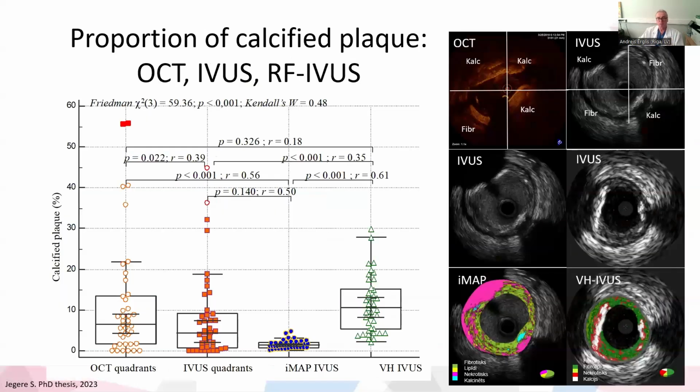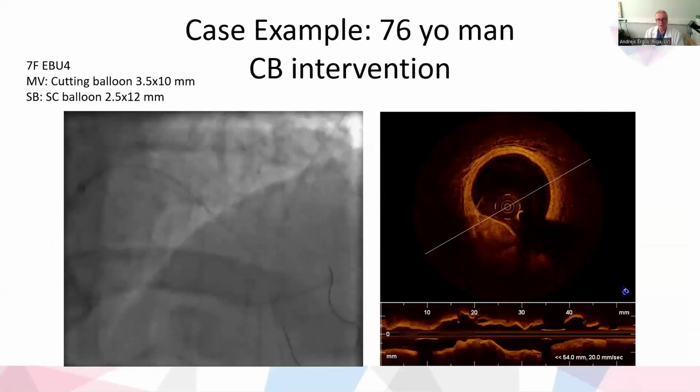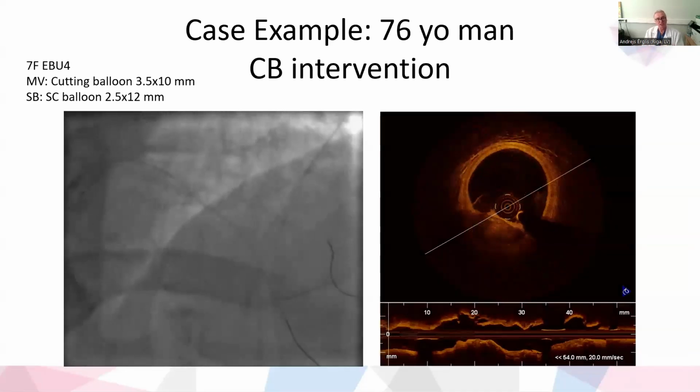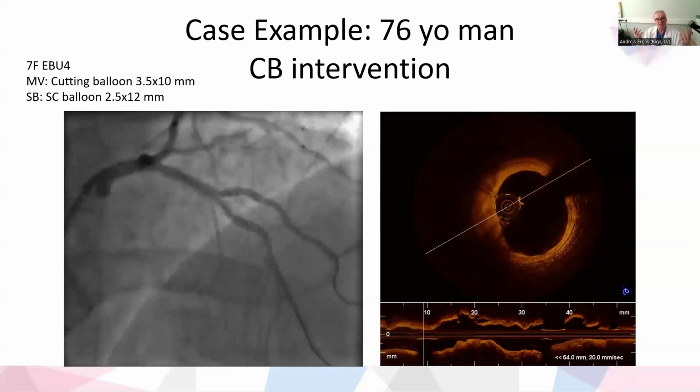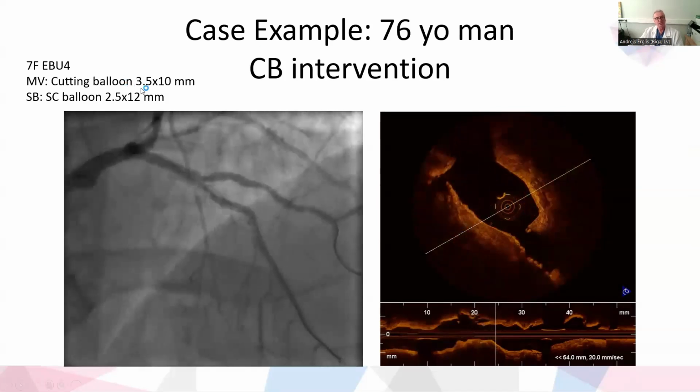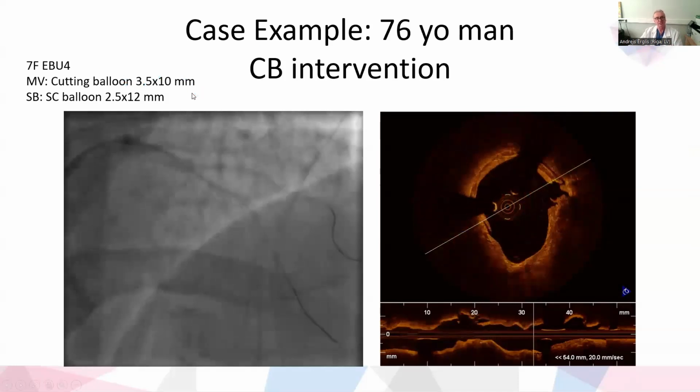This is actually a bit of continued research, mostly about plaque volumes and calcium volumes, with OCT, IVUS, IMAP and VH, and then you can see. But again, in the future there will be even better and more precise software, I'd say. So it is treated, as I said, because we know the real dimensions. Because we know the real dimensions, then we can choose the right devices.